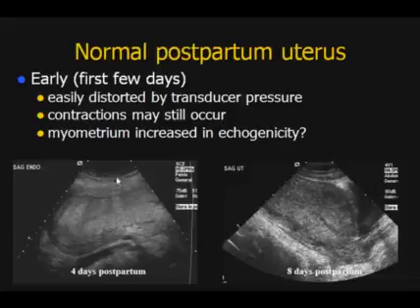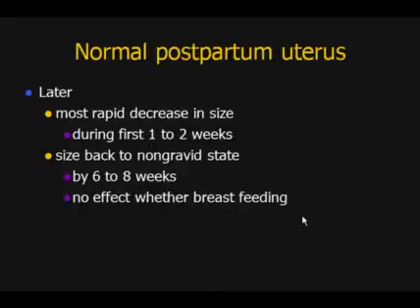The other thing I've noticed in the early postpartum period, and here's a patient 4 days, is that the inner myometrium can be hyperechoic, more hyperechoic than we're used to. Here's a patient at 8 days. So much, in fact, that sometimes, at least on first look, you may wonder where the endometrium is. Is it just this thin area? Is it all of this? But if it's all of that, that's quite thick, and the same thing here. But this is just the inner myometrium, and I've just noticed that in the early postpartum period, it can be hyperechoic, more so than usual. It may even occasionally give you trouble deciding where the endometrium is located.